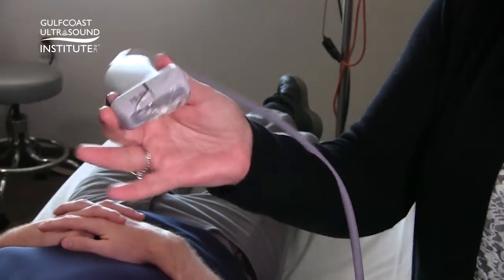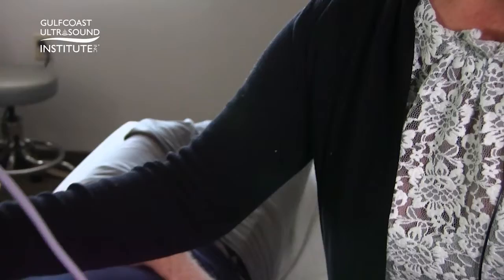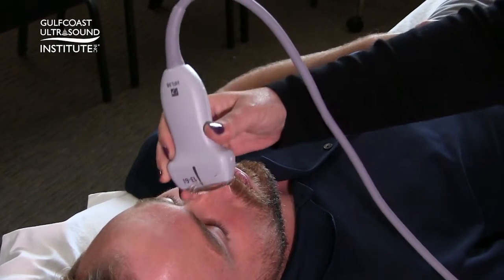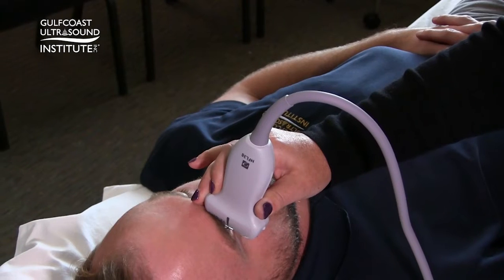Hold the probe in the first three fingers and use your remaining fingers to rest your hand on the patient's face — either the nose or the orbital rim. Most of the pressure will be transmitted there, and you'll just very gently touch the probe to the eyelid.